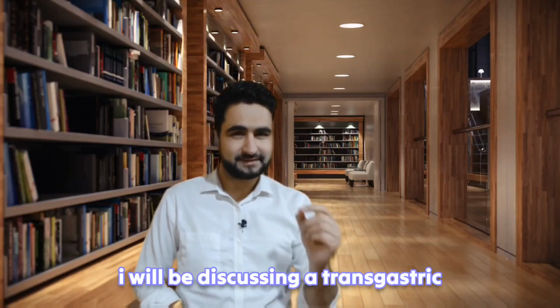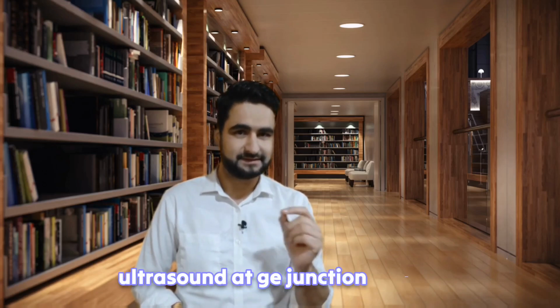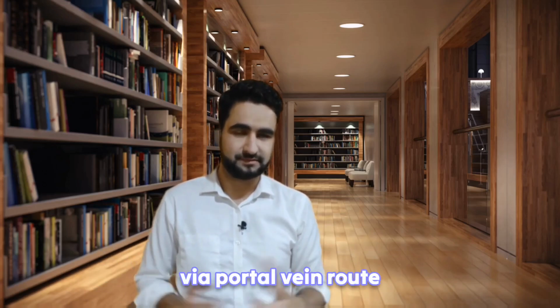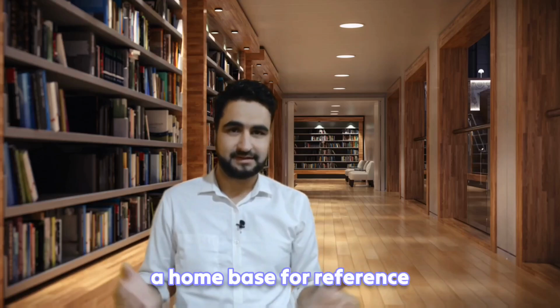In today's topic, I will be discussing the transgastric approach in linear endoscopic ultrasound at GE junction station via portal vein route. In this route, I will be discussing portal vein as a home base for reference. Let's start.